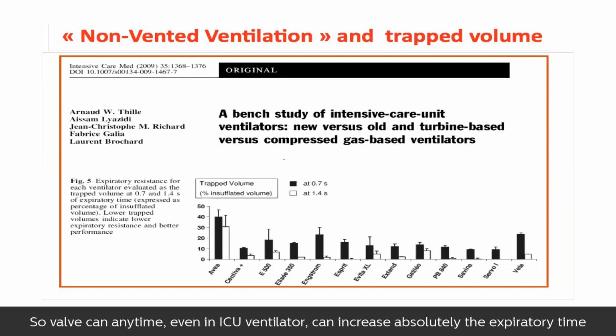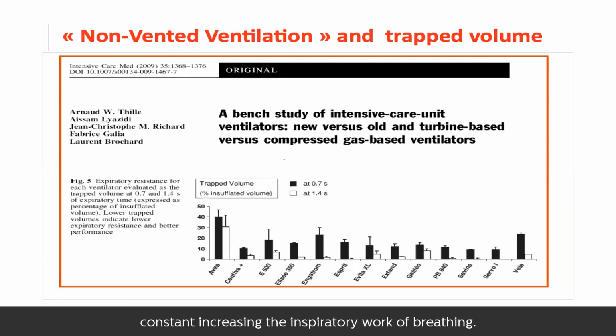So valve can anytime, even in ICU ventilator, increase absolutely the expiratory time constant, increasing the inspiratory work of breathing.